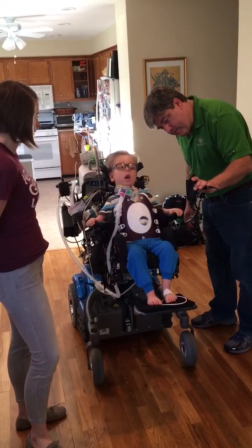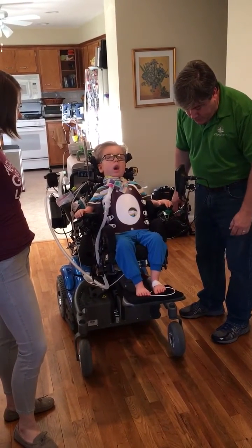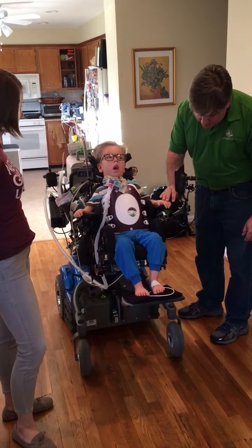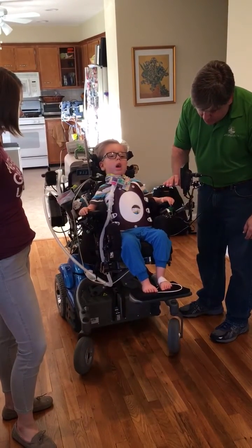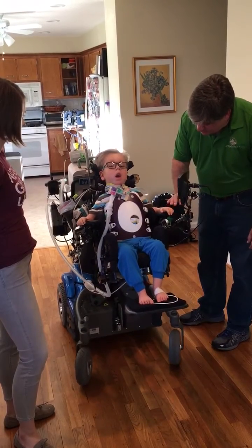All right, ready? Now, hold one of them down. Your choice. Either one. Maybe this one — you get to click it. Click it. See that? You do both.